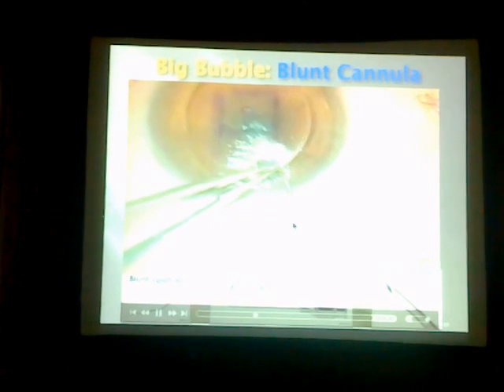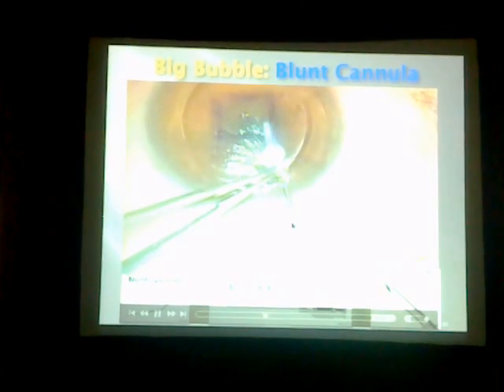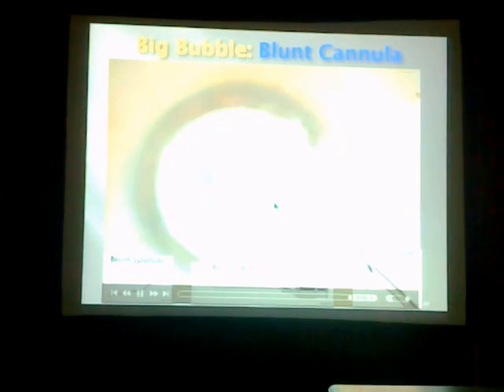My preferred technique now is doing the groove, then making a very small lamellar dissection, making a very small hole with an insulin needle, and then with a blunt spatula, making a groove or tunnel in the stroma as deep as possible. Then we go with the cannula bevel-down and inject air. This technique has a very high success rate because we are very near the Descemet's membrane and using blunt instruments rather than sharp ones. This produces the big bubble again after a single injection.